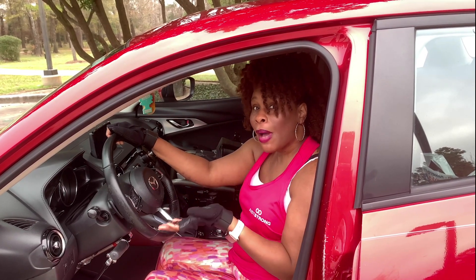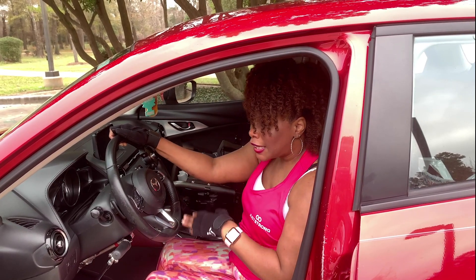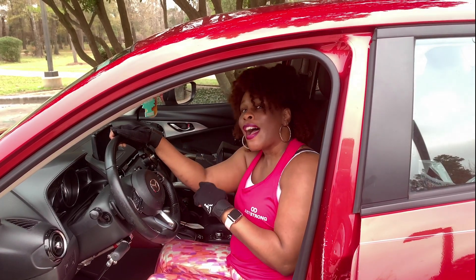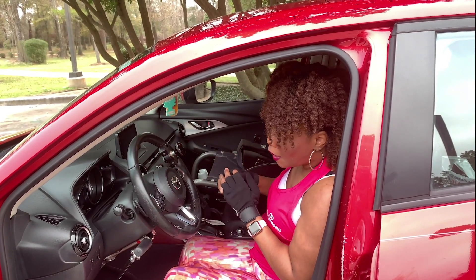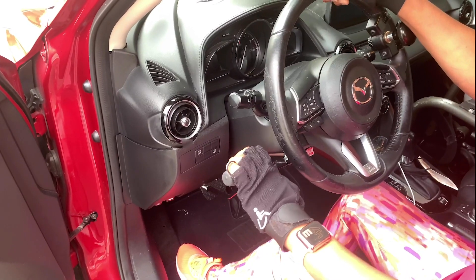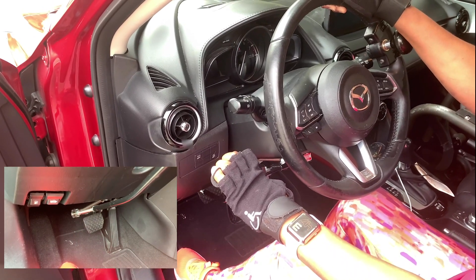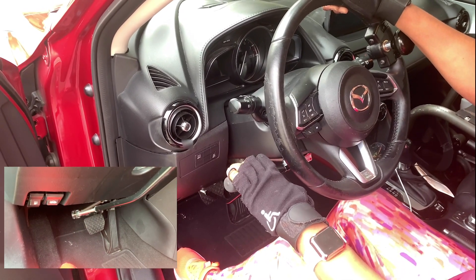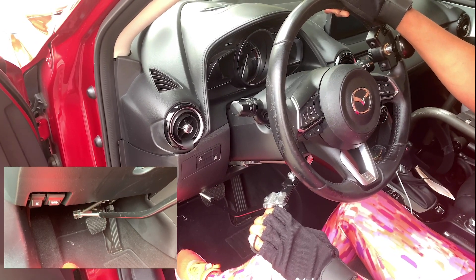Now that you know how I get in my car and how I get my chair in my car, let me show you exactly how I drive. This is my hand control, and it is connected to the gas and brake. When I want to brake, I grab it and push in. I come back up so that I'm not engaging both, and I go down for the gas.